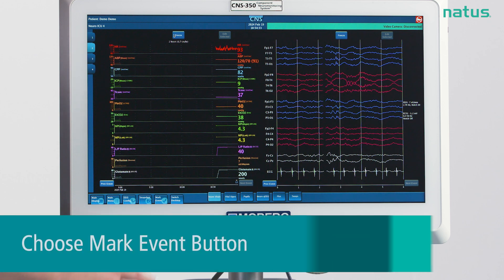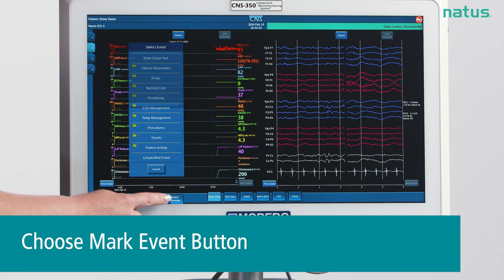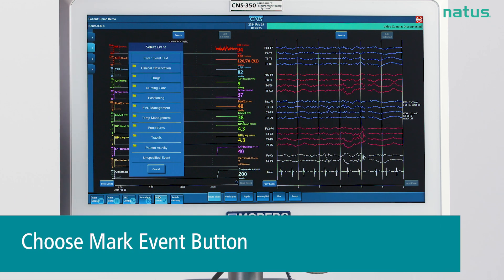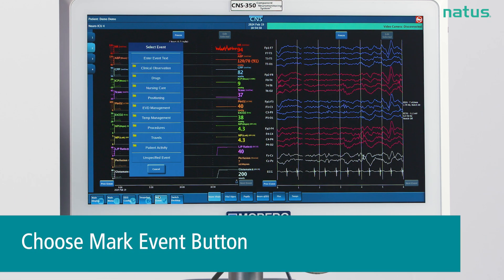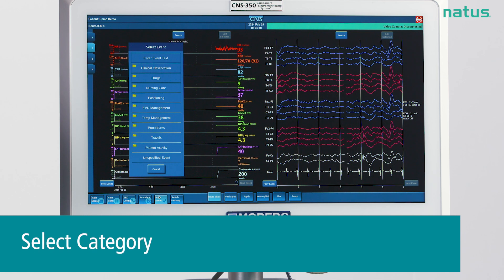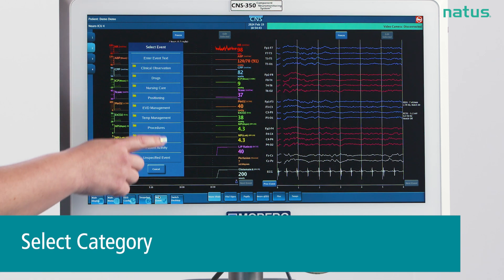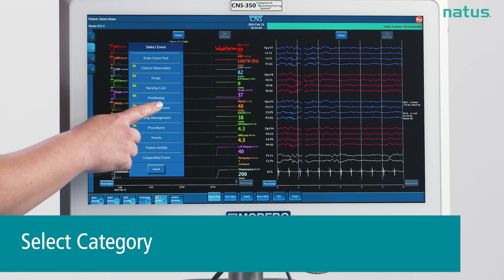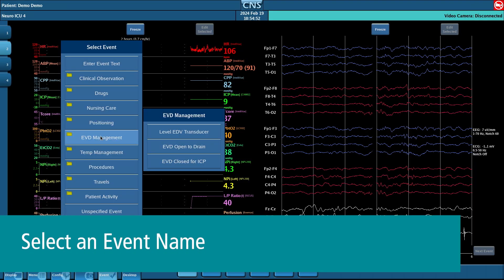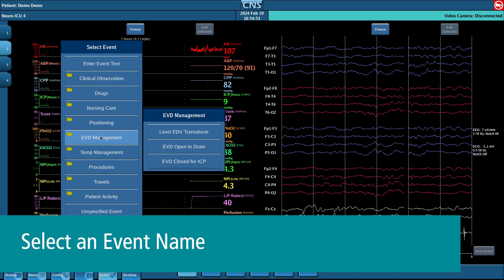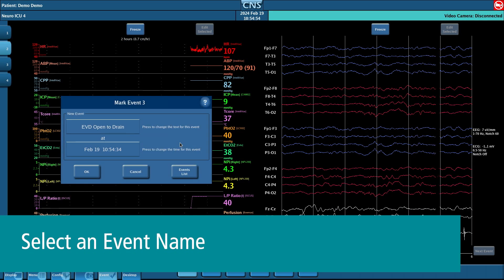To do this, tap the mark event button at the bottom of the screen. You will see the categories list pop up. Tap on the appropriate category, such as EVD management, and the events list for the category comes up. Choose what it is that you did, and then hit OK.